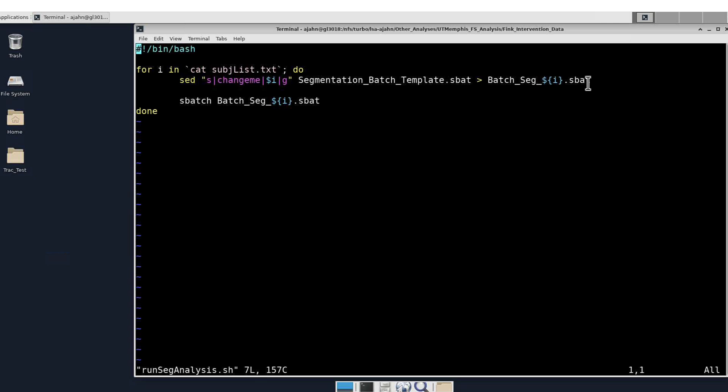This creates a new sbad file, which is then submitted using sbatch.